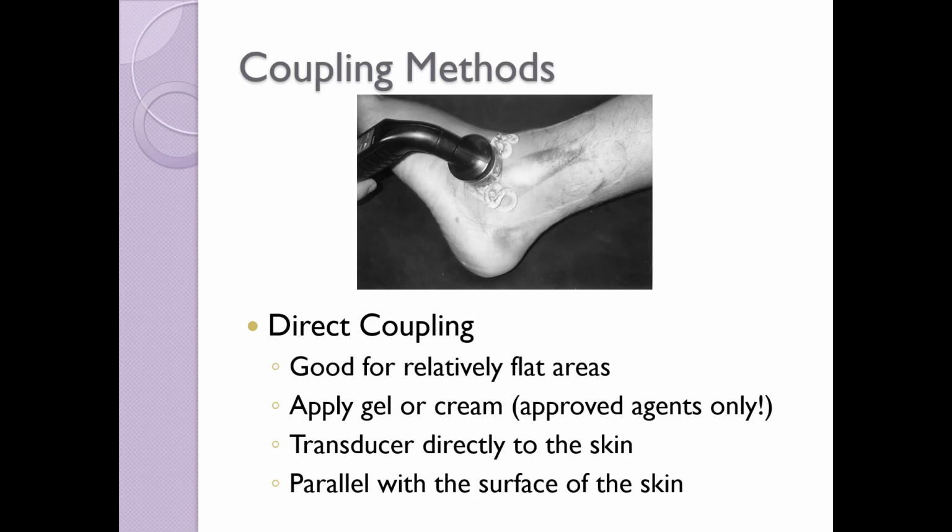This is a good treatment for relatively flat areas so that the energy strikes the tissues at a 90-degree angle. Angles less than 80 degrees significantly reduce the effectiveness of treatment. We apply gel liberally to the body part. We want to use a firm, consistent pressure to hold the sound head in contact with the skin. Too little pressure creates an insufficient couple.